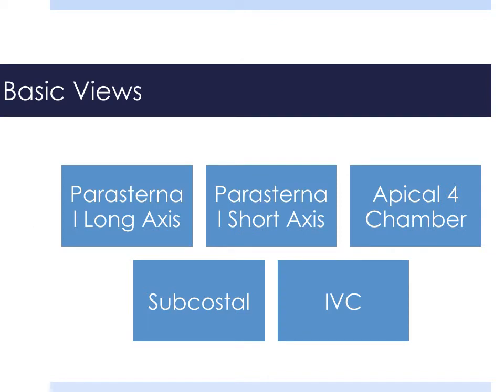As we have learned, the basic views of our focused heart ultrasound are the parasternal long axis view, parasternal short axis view, apical 4-chamber view, subcostal view, and with a slight rotation of the probe from a subcostal view, we can visualize the IVC.